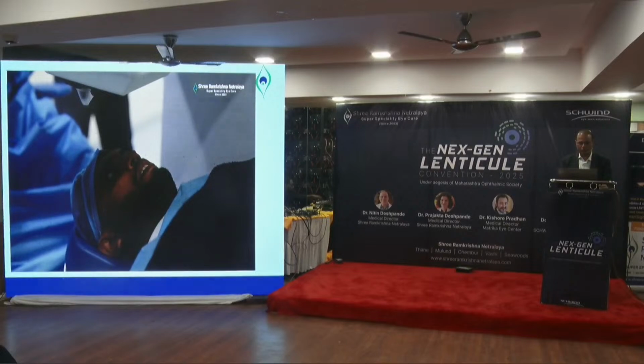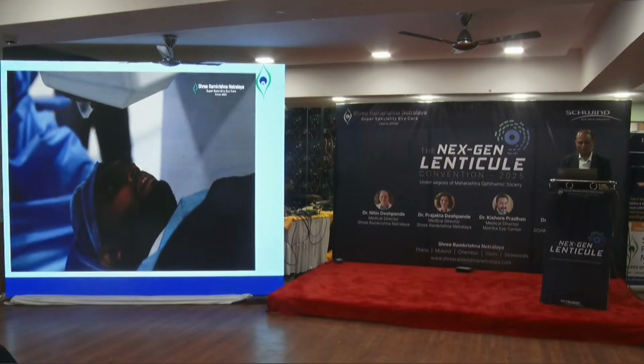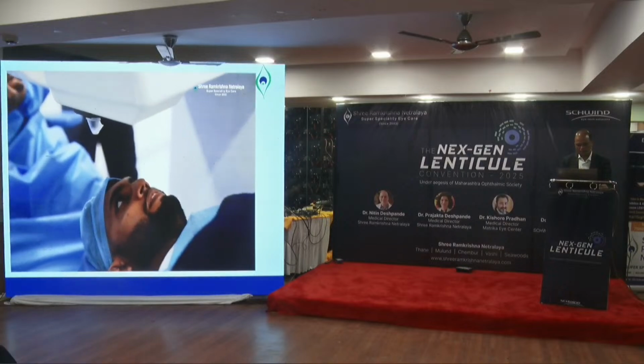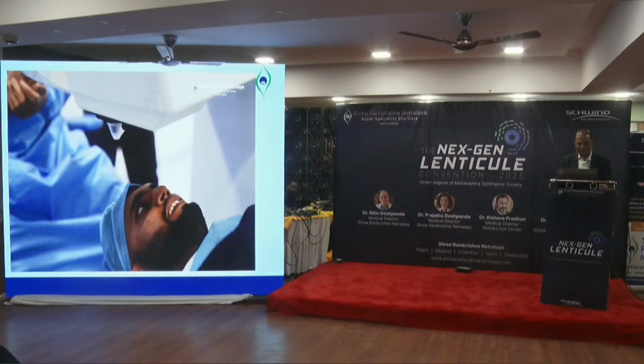After that, I'll remove the cup and I will take you little up, and then I will look at your eye from the microscope and just remove that lenticle which is already separated. So the whole procedure is going to be only few minutes, and you need not worry. You will be absolutely okay.